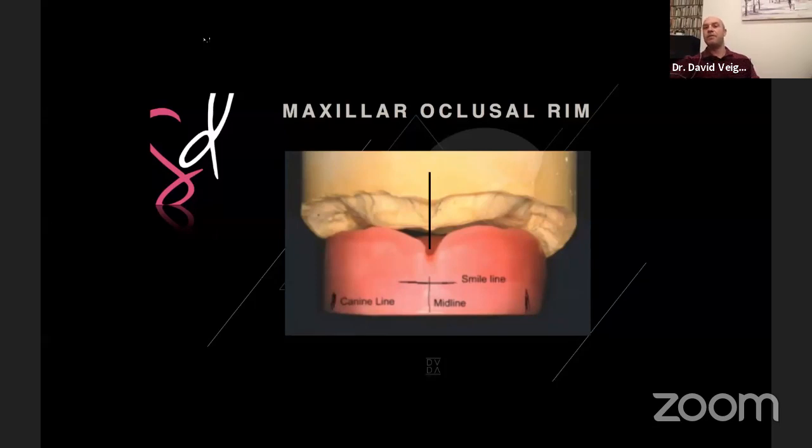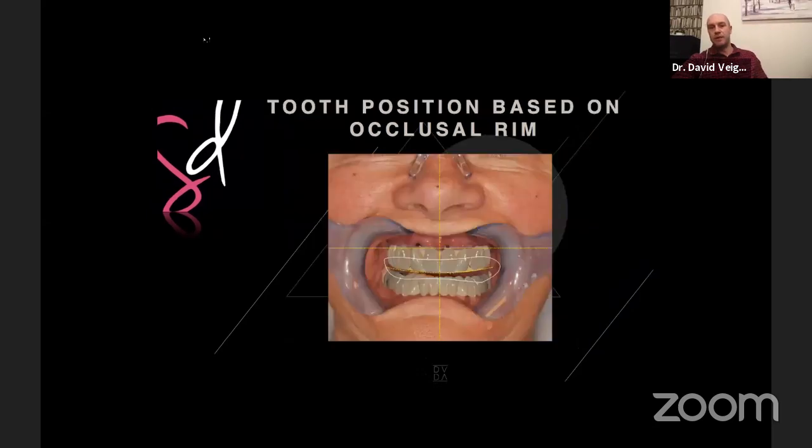Anything above that is going to be in our FP2, FP3 range. So I like about 18 millimeters from my implant shoulder to my future incisal edge for an FP3 style bridge, and that will give me a 3 millimeter occlusal band of prosthetic soft tissue replacement.